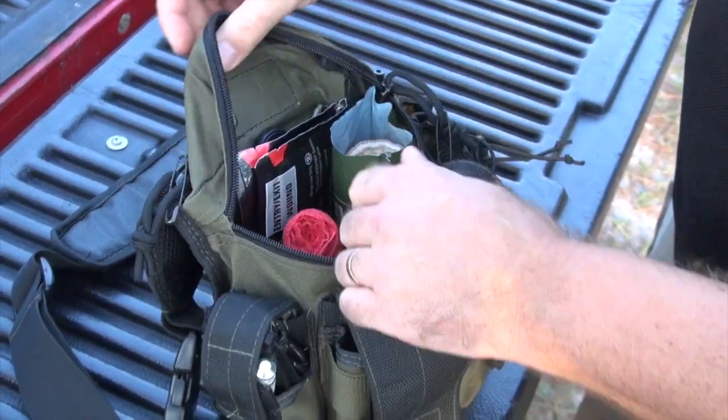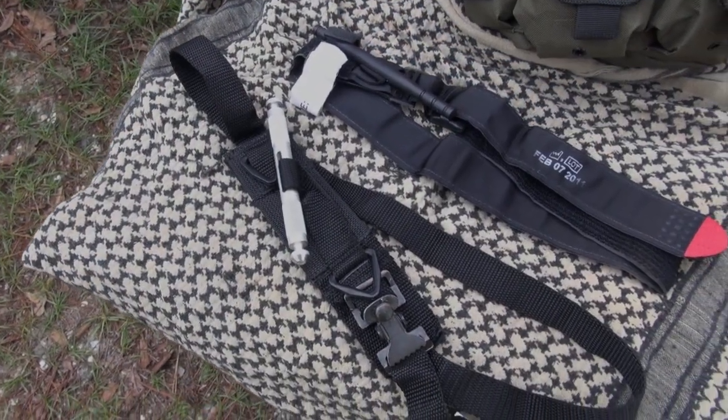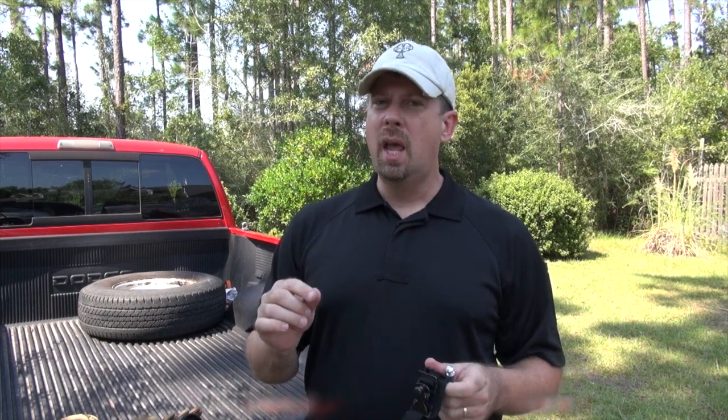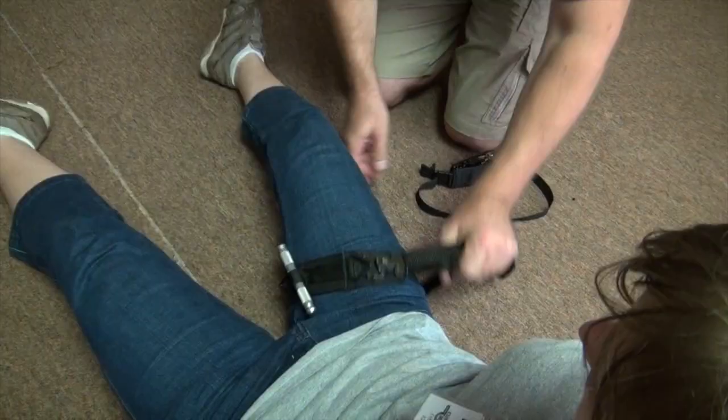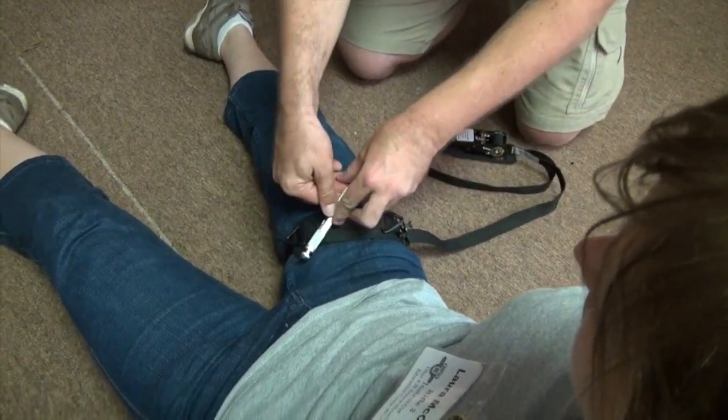We open up the main compartment and first things first, we've got a tourniquet. If your patient or yourself has a severe arterial bleed — one of your arteries in your arms or legs has been severed — you literally have minutes. I'm not talking five or ten; I'm talking two or three minutes to stop that blood from flowing before that patient dies.